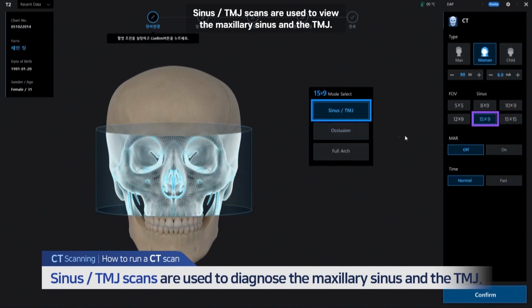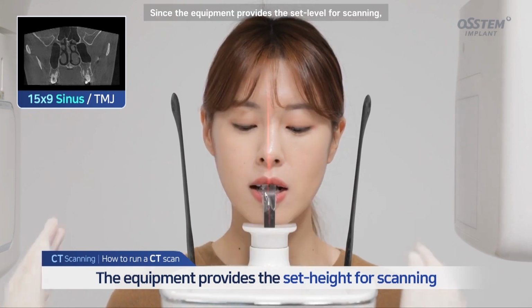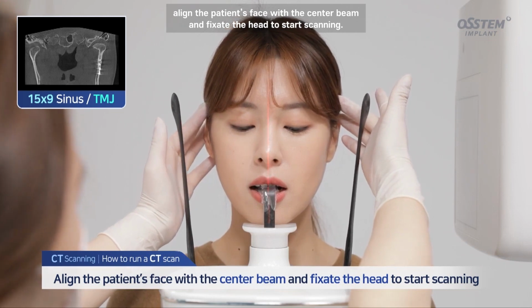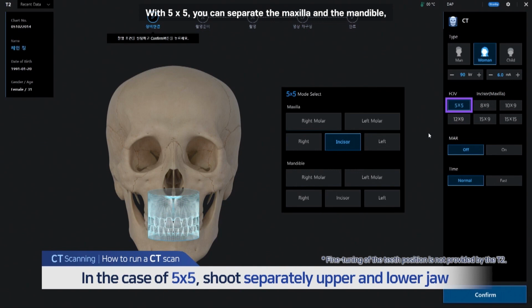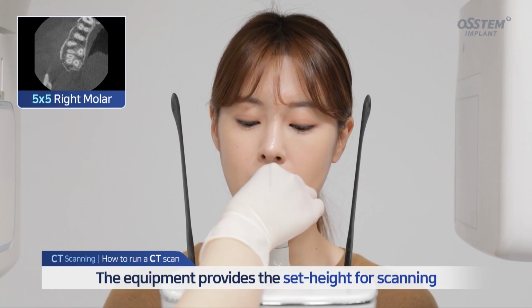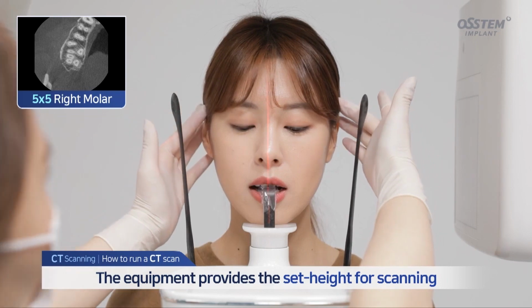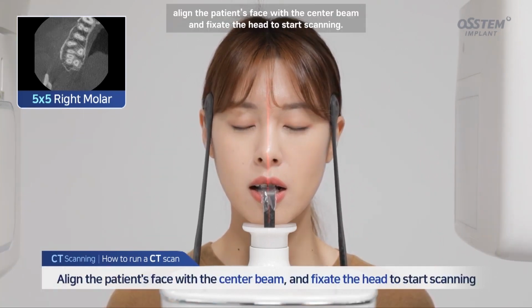Sinus TMJ scans are used to view the maxillary sinus and the TMJ, since the equipment provides the set level for scanning. Align the patient's face with the center beam and fixate the head to start scanning. With 5x5, you can separate the maxilla and the mandible, and choose one of the 5 points for scanning. Since the equipment provides the set level for scanning, align the patient's face with the center beam, and fixate the head to start scanning.